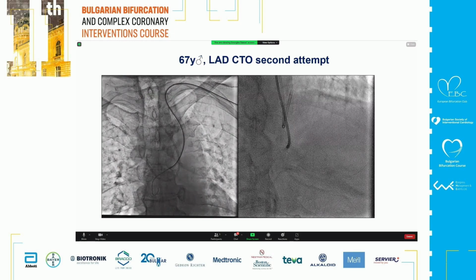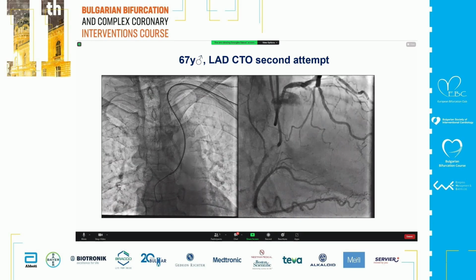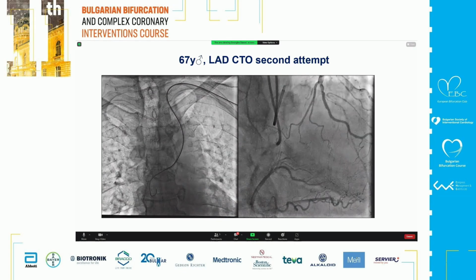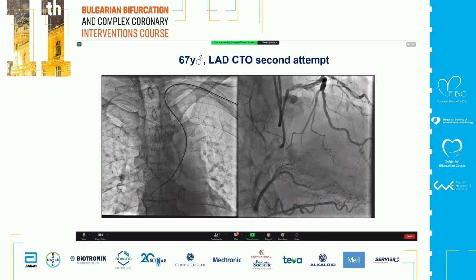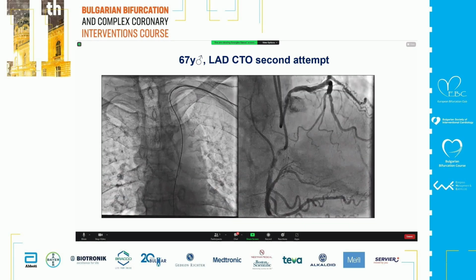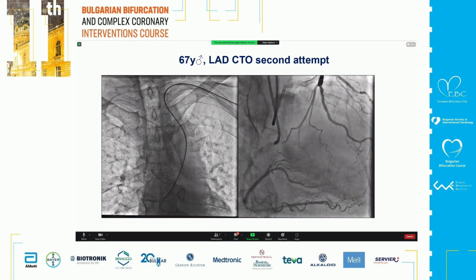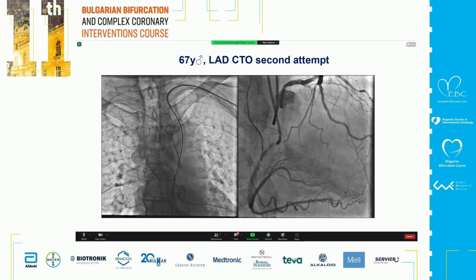As far as the topic is for fellows, many experts are really challenging anymore the validity of simple techniques like the parallel wire technique. Maybe due to the fact that the cases they're dealing with in routine practice might not reflect the easiest of the stuff, and maybe the mind is really skewed by the complexity, because if someone is always into the JCTO score 5 every single day, then maybe parallel wiring is not a routine thing, but still very relevant in my view to many. And many patients will benefit from such a procedure.